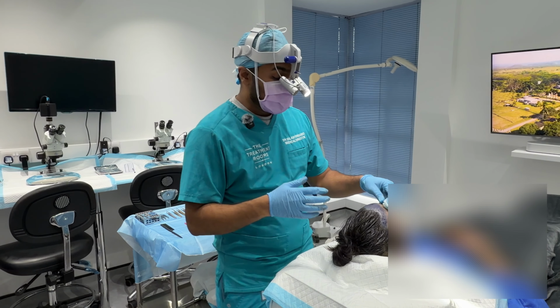You can see that I'm using super high magnification. I can see all of my hair follicles that are native to the scalp, and I can see my incisions really clearly, and I'm making sure there's really good, healthy space between the native hairs and my incisions to protect those existing hairs as well. So a hair transplant on its own is not going to stand up and create a dense result. But when married together with the native hair, it can create a really beautiful, full and dense result. So protecting your native hairs with good magnification and careful incision placement is incredibly important in that regard.